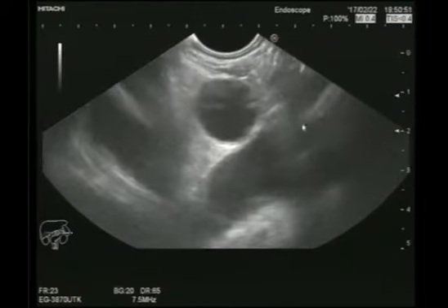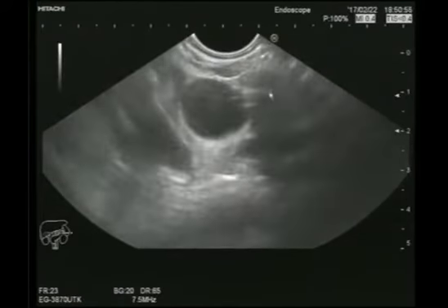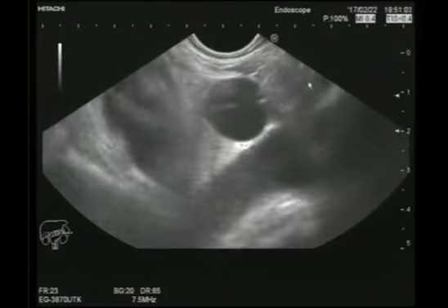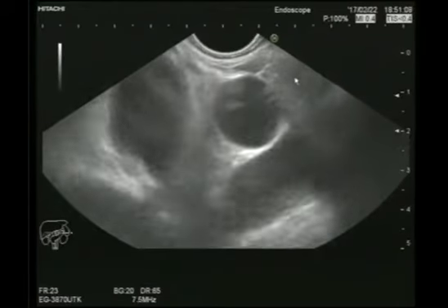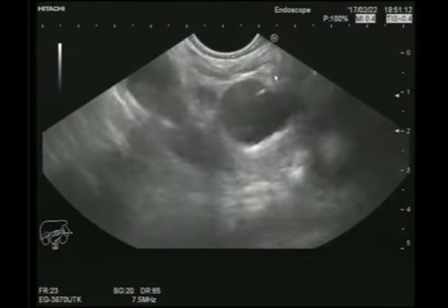aorticopulmonary window. This is the aorta, this is the pulmonary artery, and between them is the aorticopulmonary window, another site of the mediastinum, which is of interest because generally lymph node metastasis from any site will be to these sites. There is a very small lymph node, but this lymph node is not pathological.